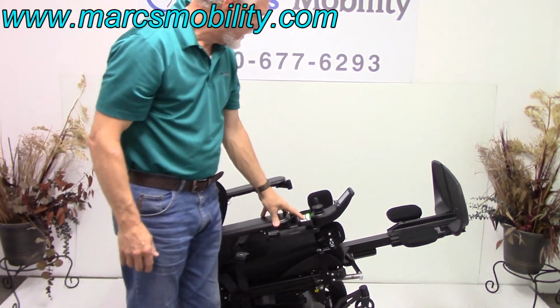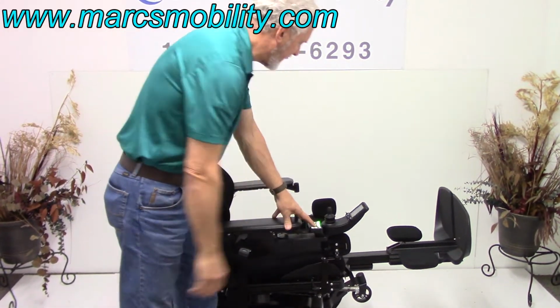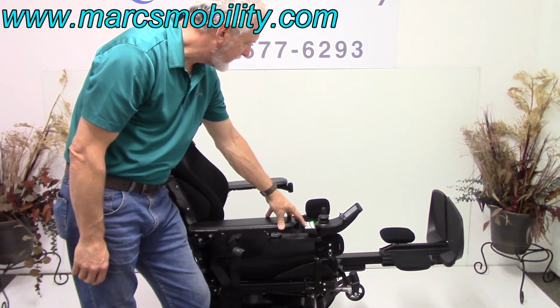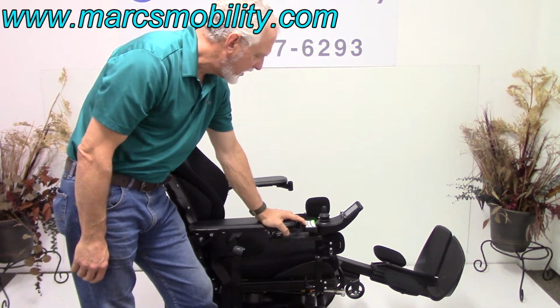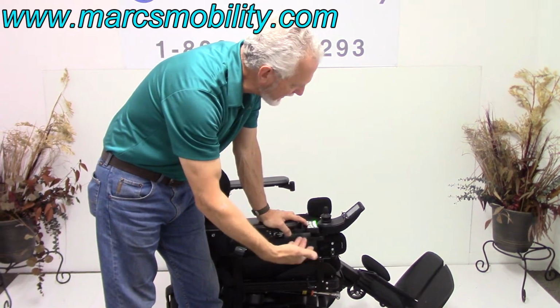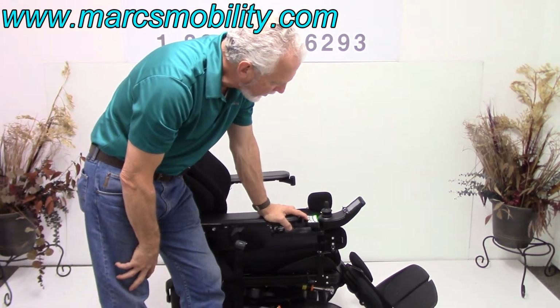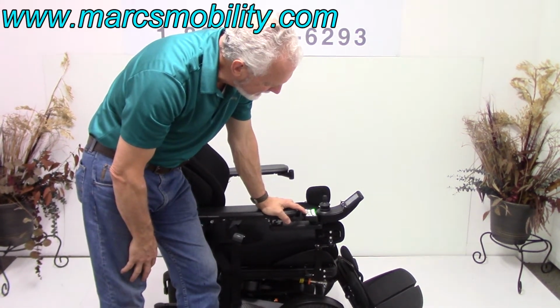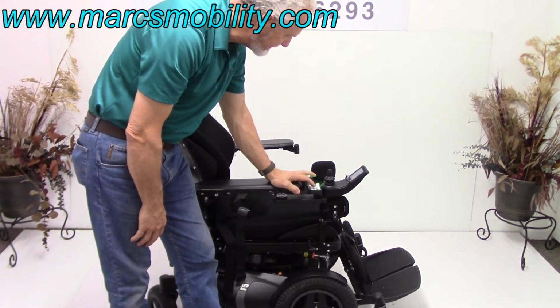So that's your, I'm going to bring the tilt back down. I'm also going to bring the legs back down here in a second. I have to switch over. So now the legs are coming back down. When you drive this chair outside, make sure your legs are always out so you have a little more clearance under the foot plate so you don't hit something and damage your electric legs. Make sure they're always out at least, I would say that far if you're outside. Okay? So that's that.